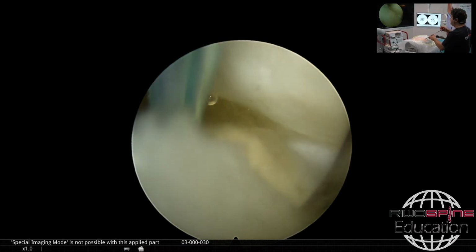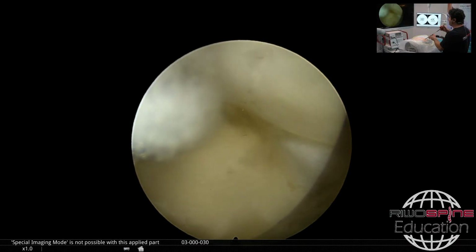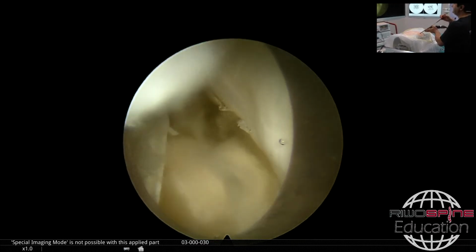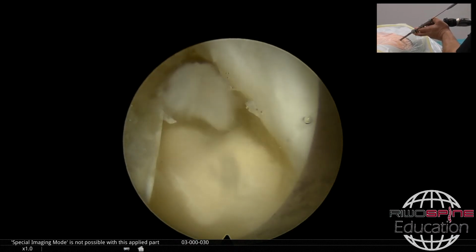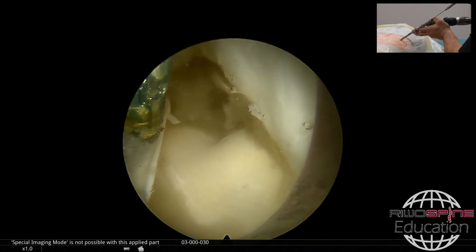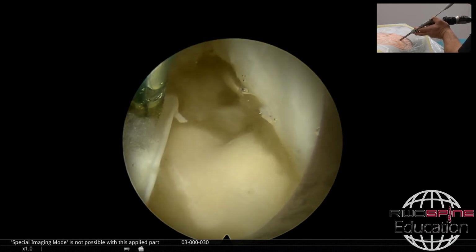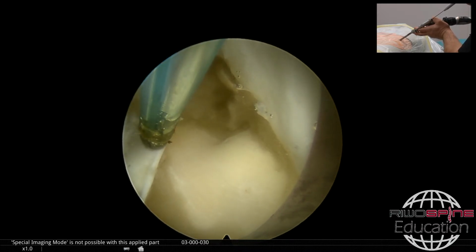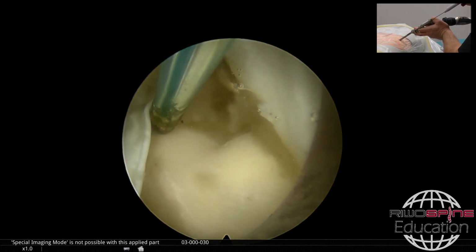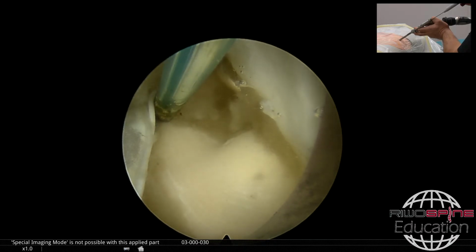And then to search for the exiting nerve root, what we usually do is rotate the opening of the sleeve to the cranial side, and also the 25-degree endoscope to the cranial side. Then we can find the exiting nerve root, as you see here at the 9 o'clock, and usually you will find extraforaminal herniations here.